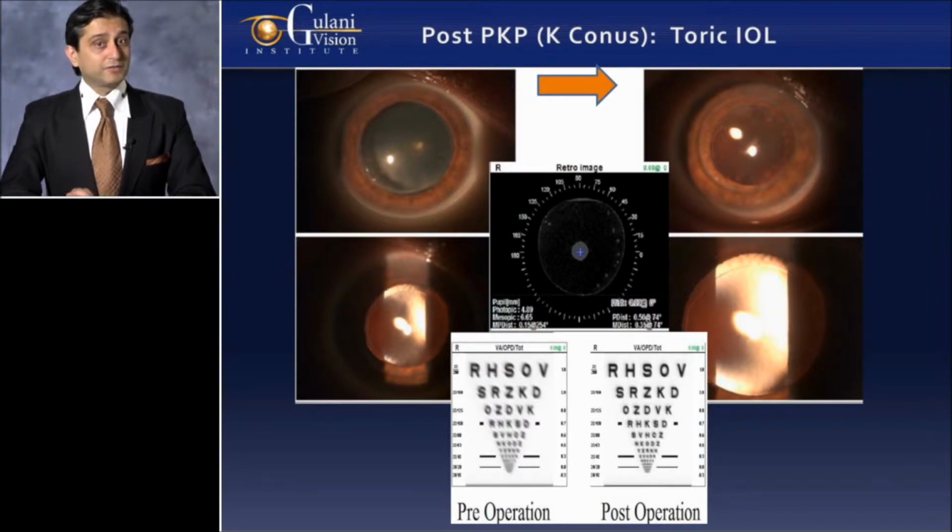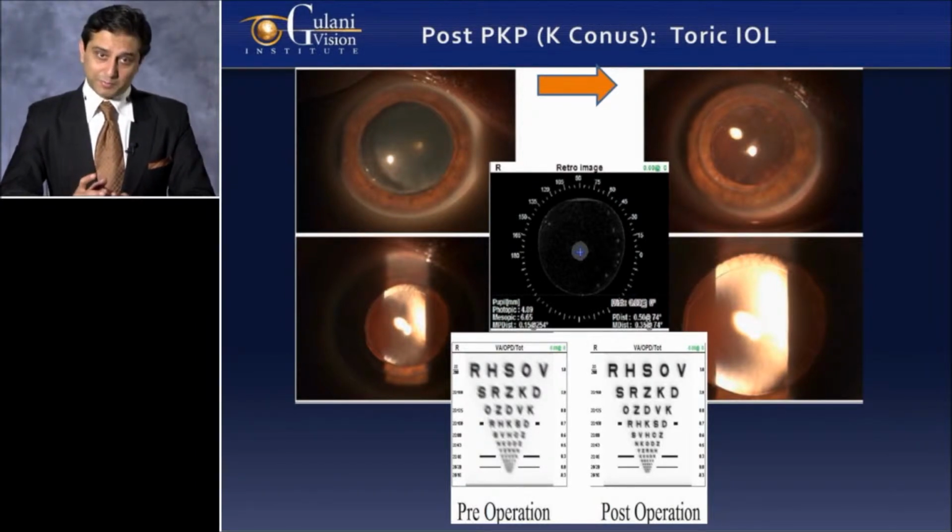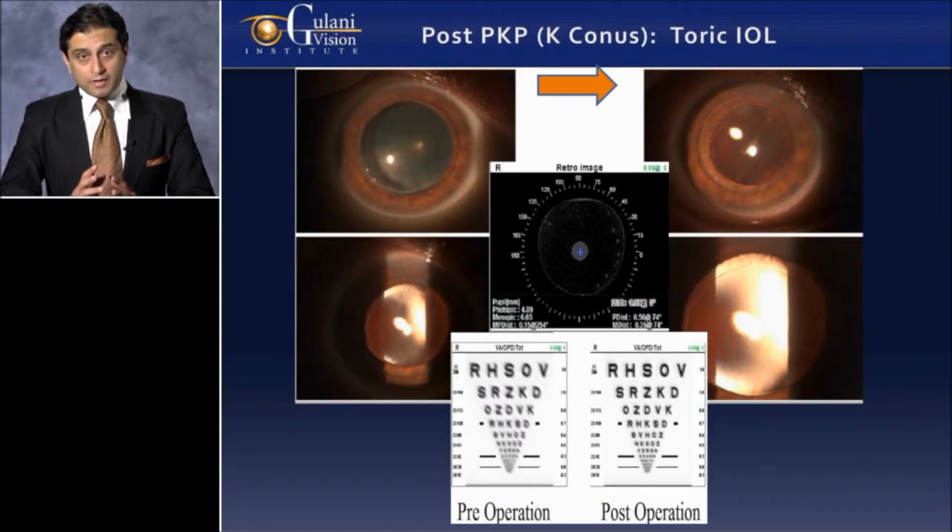Now, associated with the cataract, that's how I like to think all the time, this patient also had refractive errors, high myopia, astigmatism, presbyopia. So we take this patient in his non-dominant eye and perform a toric lens surgery. Having done that, you can see why this patient is thrilled with his outcome of 20/25 vision next day.